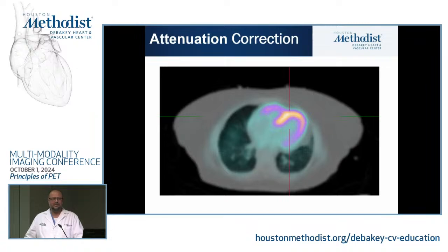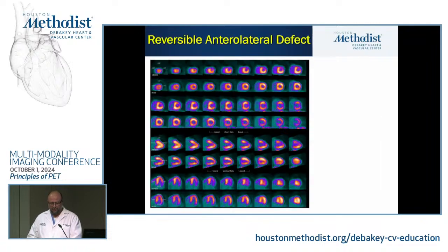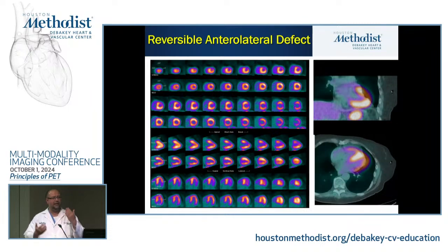And when this started, these PET-CT systems started to come in about 2005, 2007 era, and they became more used in the early 2000s. And there were publications saying that misregistration, which means that these two do not align well because the patient moved in between, means the heart is not where it's supposed to be, because you have two images and you're just putting them on each other.